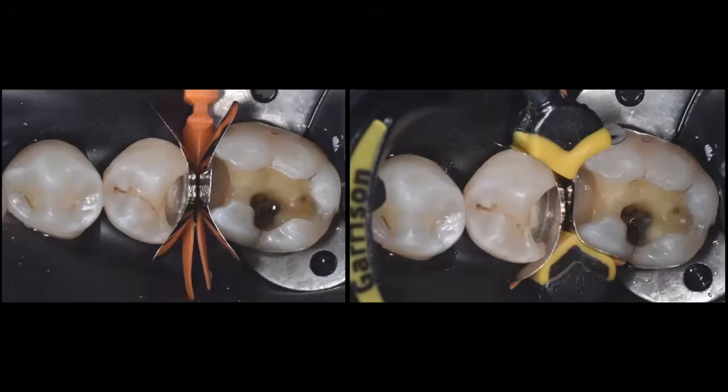And for that, you want to make sure that you use these stiffer bands, which are going to be more resistant, so you can push these bands towards one another and get a very nice contact, but most importantly, a very nice and anatomical contact. So here I chose to use those stiffer bands, and now I'm going to use the medium wedge, the medium quad wedge.